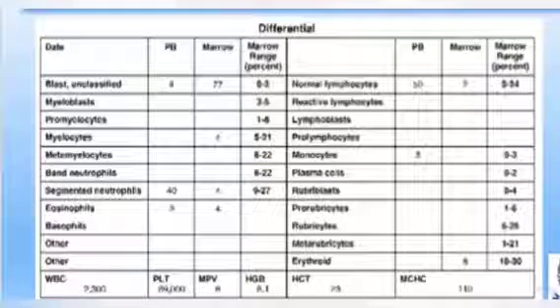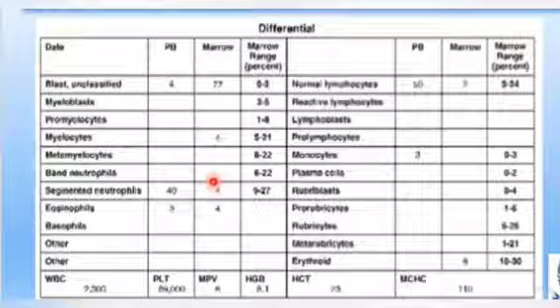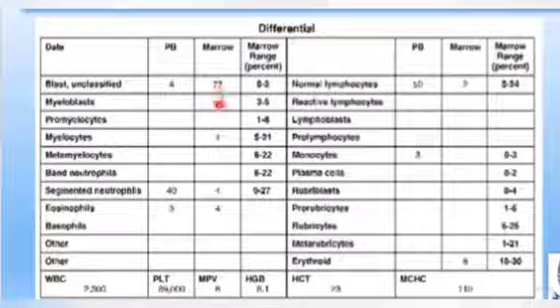So these are the myelogram or bone marrow report, in which you are going to diagnose all these types of cells, and you are writing over here, and then you finally have a specific diagnosis.